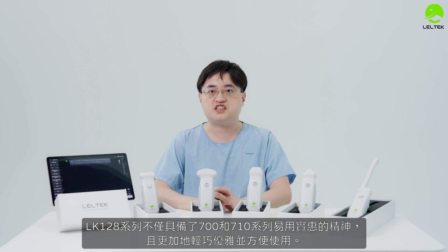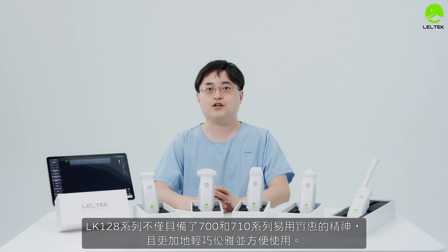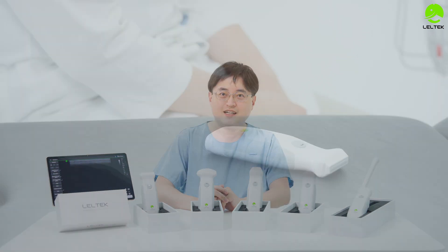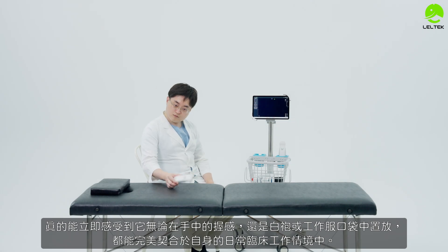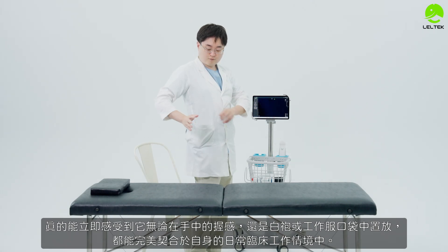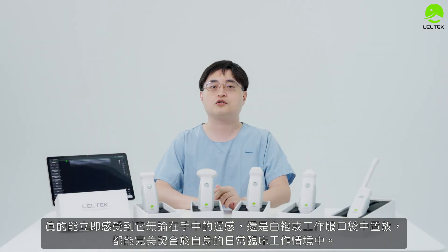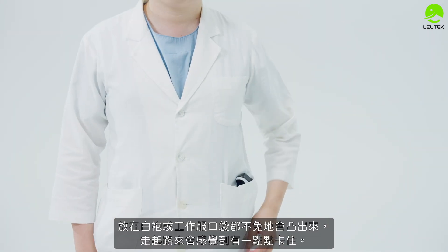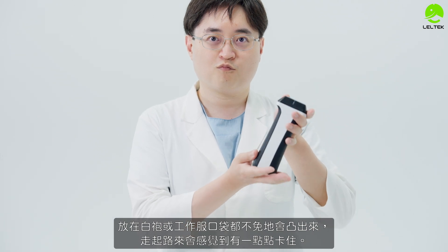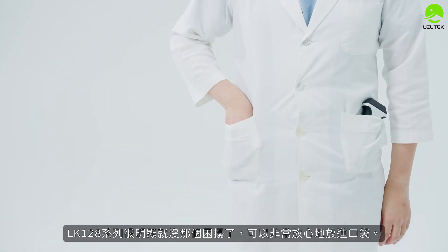The LK-128 series builds on the skills of the 700 and 710 series, but is even easier and more useful. When you first hold the LK-128, it feels natural in the hand — ergonomic all the way, and it will be stored and leveraged comfortably. It is quite practical to use.